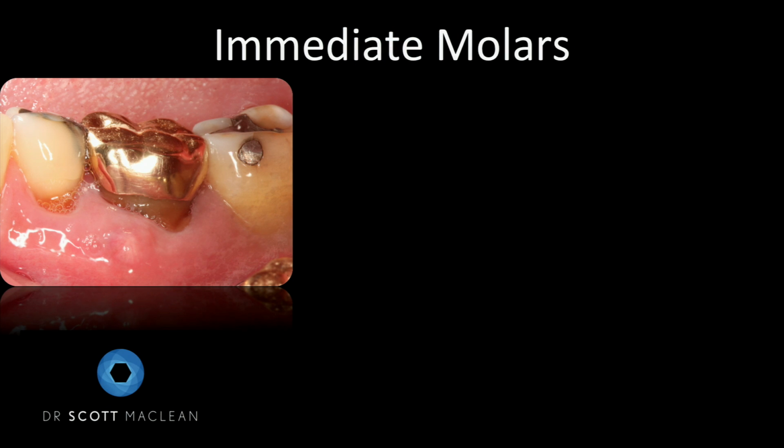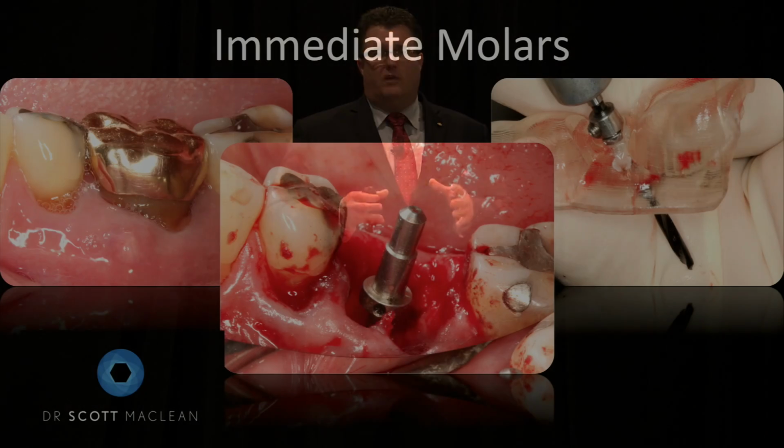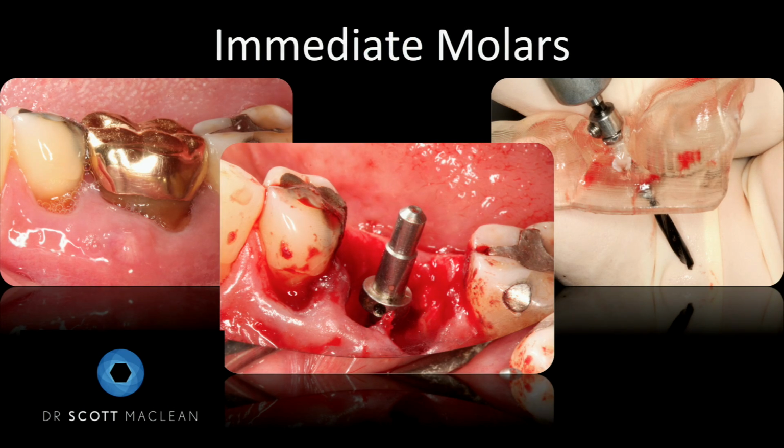If we look at another case coming up, just to finish on, here's a case where a patient came in and wanted to have a molar, so we do a guide. We want the guide so we get the tip of the implant exactly where we want it to be in the bone. Once the tip is placed, we know that the tip of the implant is 4 millimeters. So I want to underprepare that aspect, but I want to have an osteotomy going through that's 4 millimeters and then not prepare too much underneath this.